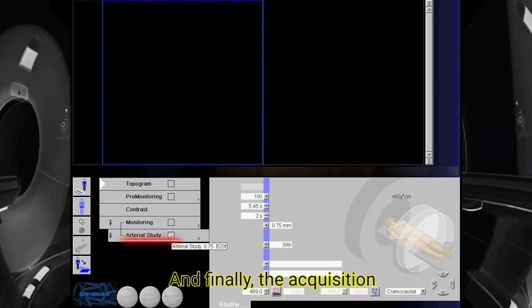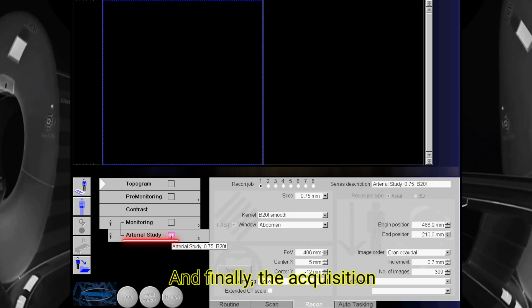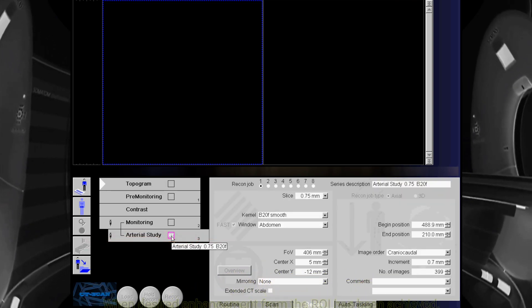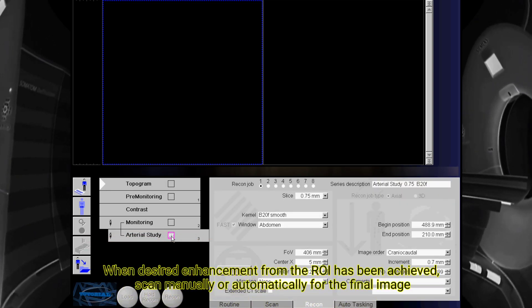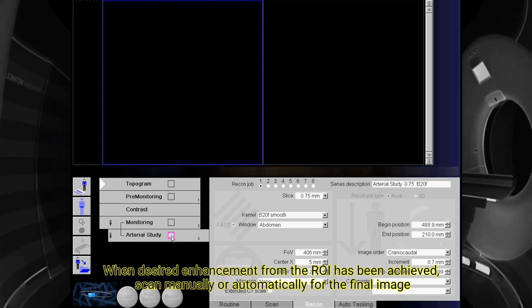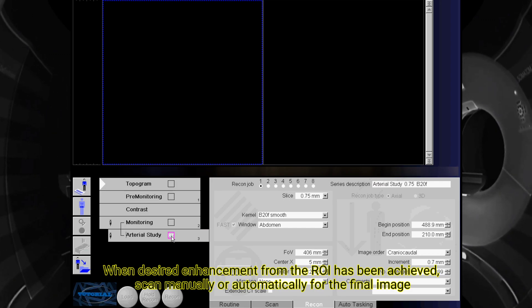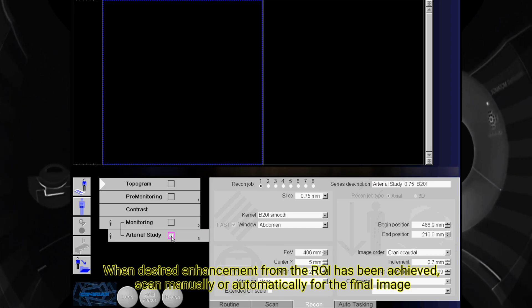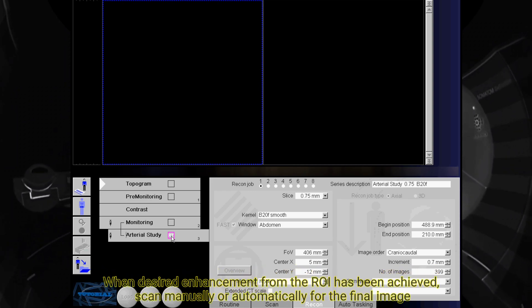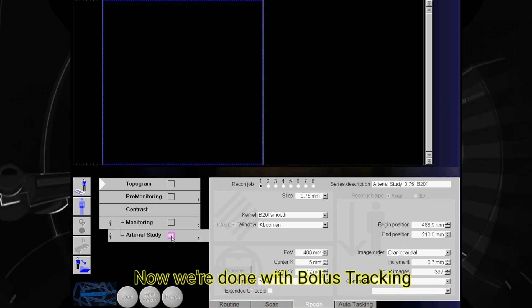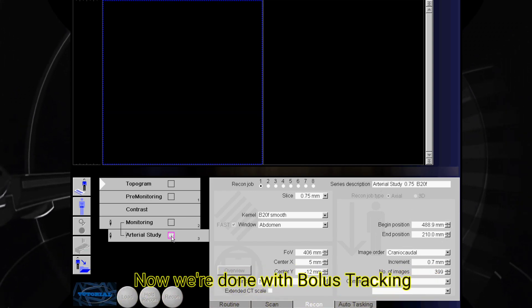And finally, the acquisition. When the desired enhancement from the ROI has been achieved, scan manually or automatically for the final image. Now we're done with bolus tracking.